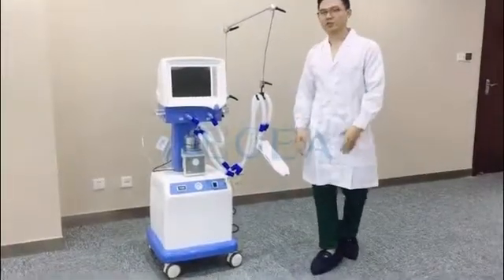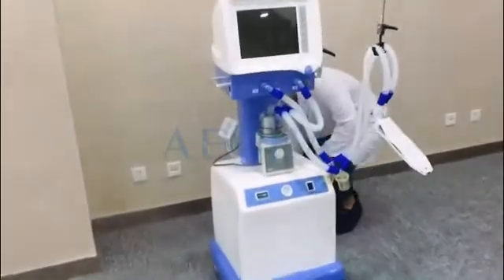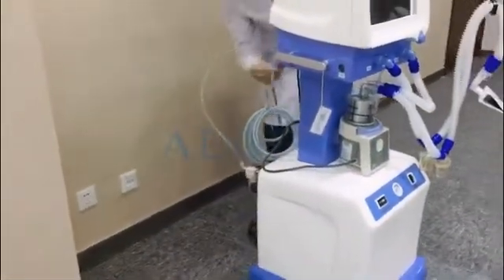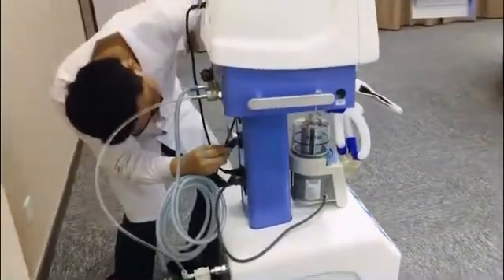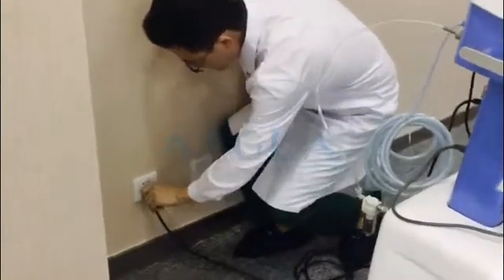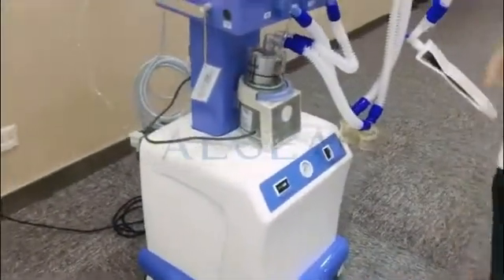Let me show you how it works. First, let me connect the plug and insert the socket. And connect the AC.